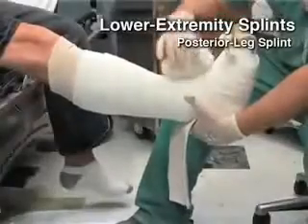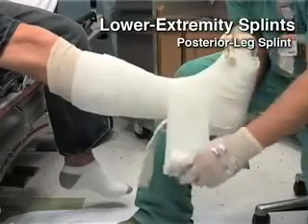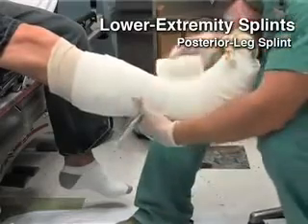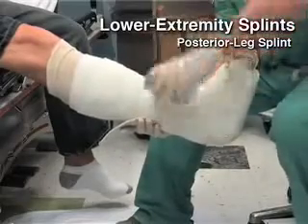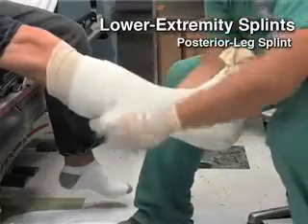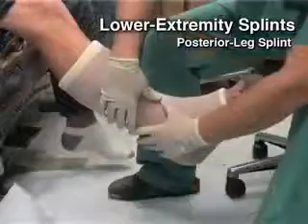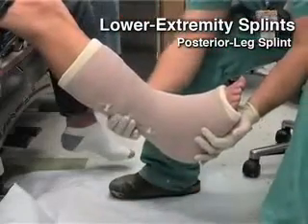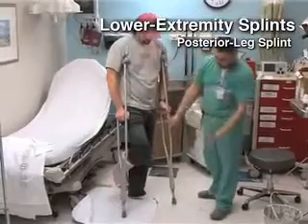A posterior leg splint is used to stabilize severe sprains, reduced ankle dislocations, and fractures of the distal leg, ankle, and foot. The splint extends from the metatarsal heads to just below the fibular head while maintaining a 90-degree angle at the ankle. Be sure to keep the fibular head free to avoid compression of the adjacent peroneal nerve. Lower extremity splints are not designed for weight bearing, and the patient should use crutches to walk safely.